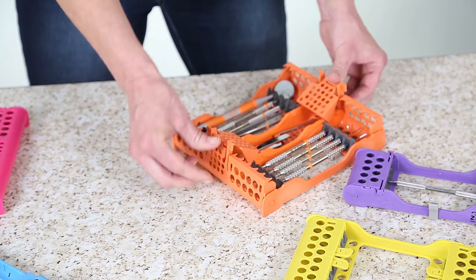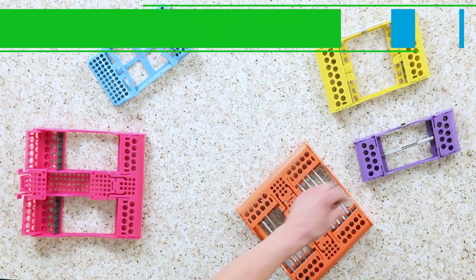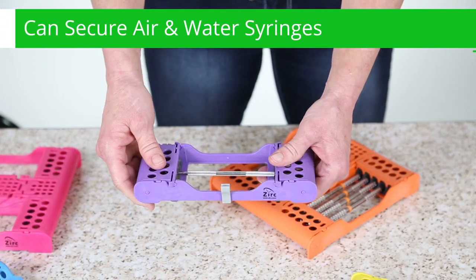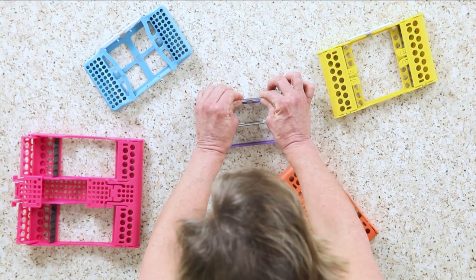The design of the EasyJet cassettes, as you can see, is intended for optimal circulation and drainage of your cleaning solutions. The 5- and 8-place cassettes also come with a clip to secure air and water syringe tips. You can add or remove clips to fit your practice needs.